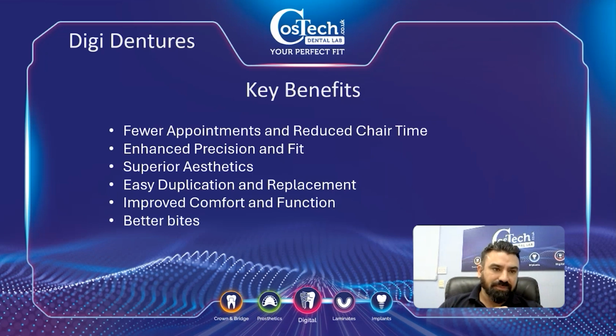Better bites. With the scanning technology that we have, there are multiple ways that you can actually get the bite more accurate. If they don't have a stable bite, you can use the denture, which I'll go into in a minute, as one of the workflows.